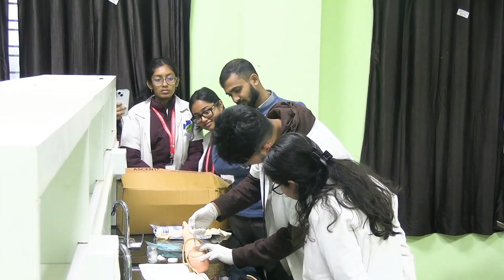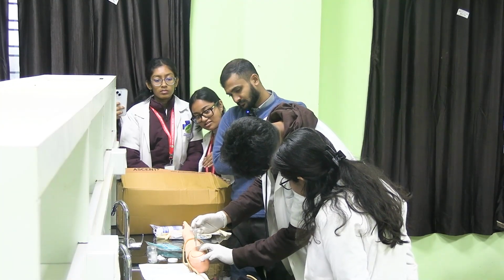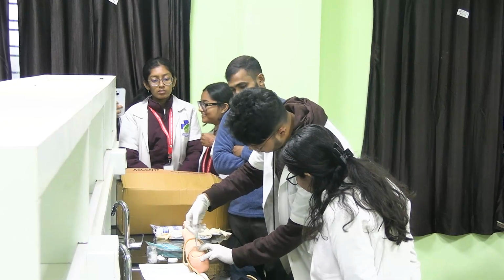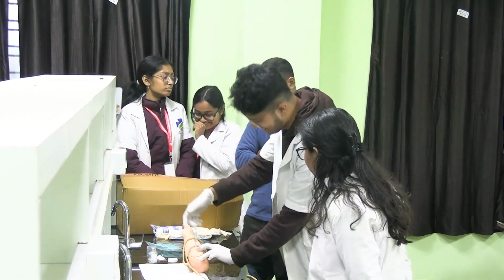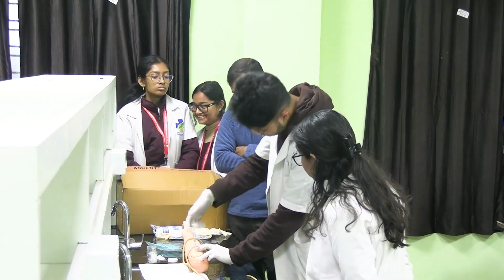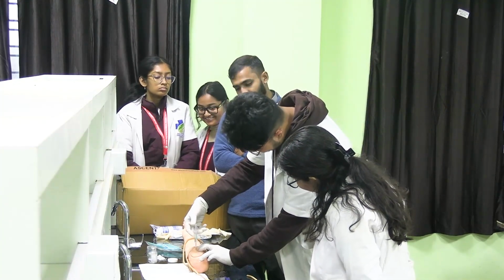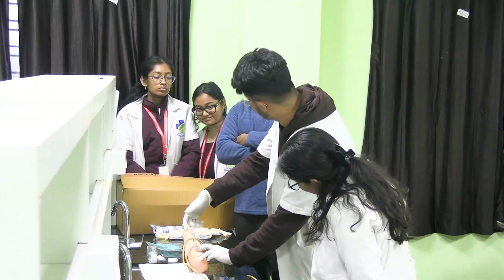After I'm done inserting, sir, I'll make sure there's no leakage, sir. If blood comes out, then I'll back off and try with a new syringe on a different spot. Then I will introduce the medicine. How will you introduce? Slowly, sir. How long? 30 seconds to 2 minutes. Sir. Okay.